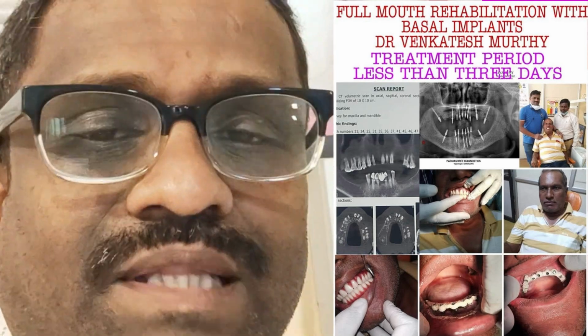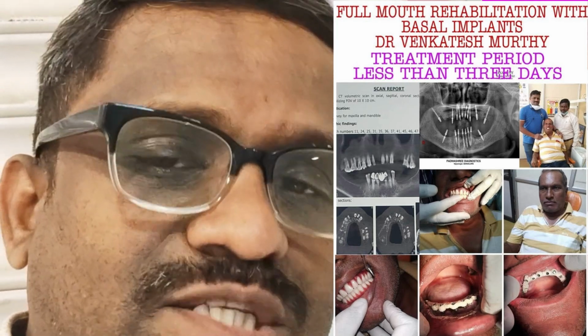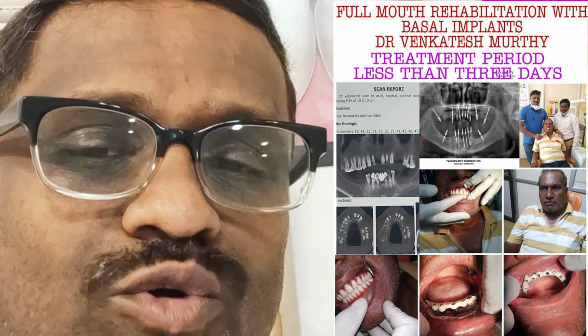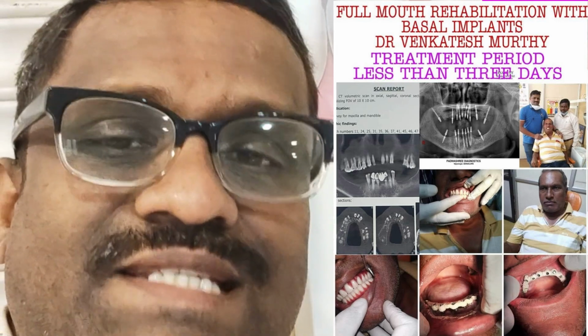So overall the implant of choice here in the maxilla as well as in the mandible, first choice is BCS, followed by, in some areas I do prefer placing compressive implants of different size and length.